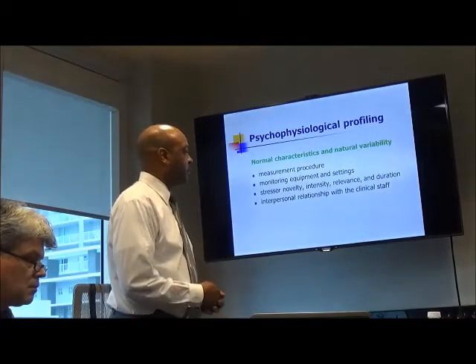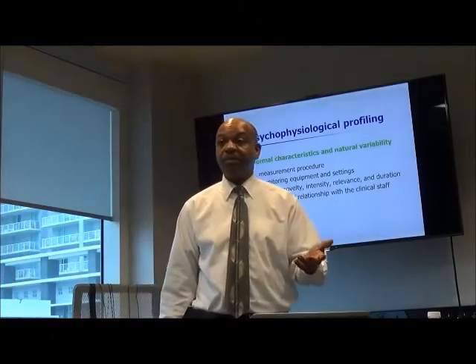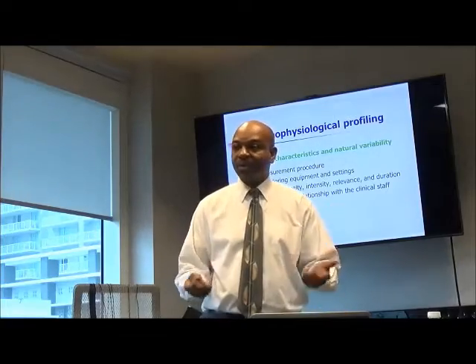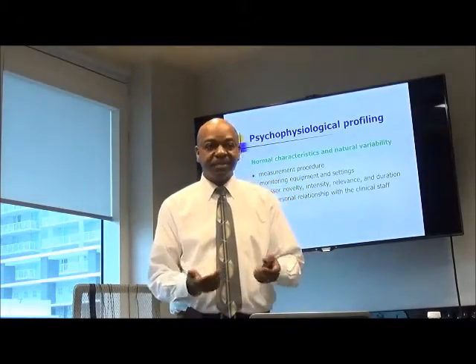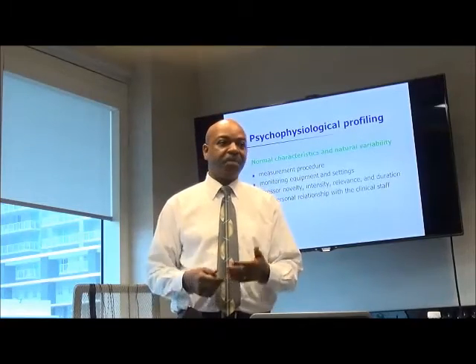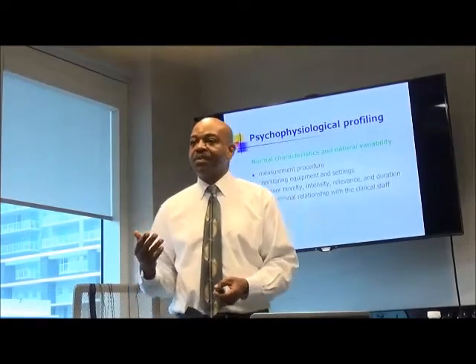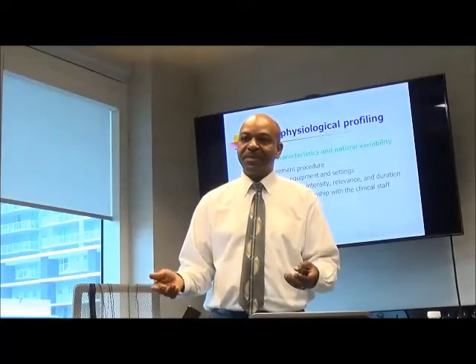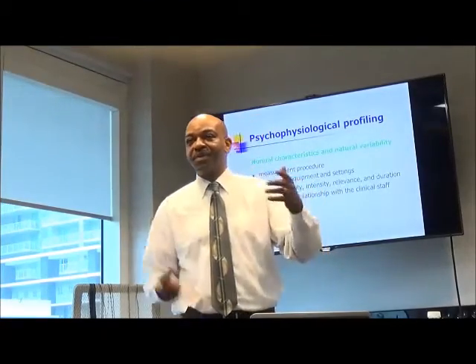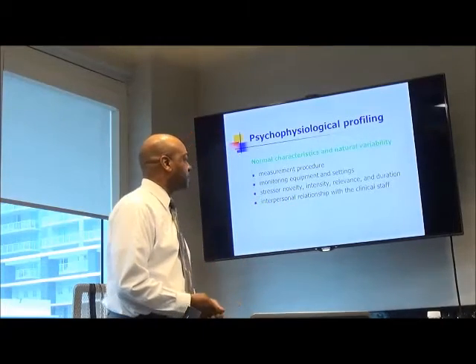Relationship with the staff. So again, this is one of the reasons why you want to do the stress assessment early on before you start doing other work with them, because it changes. Once they start to see you as somebody that's helping them, and you're teaching them how to relax, sometimes even just when they come into your office, they start to relax before you put any sensors on them, just because they're starting to associate coming there and seeing you with relaxation.